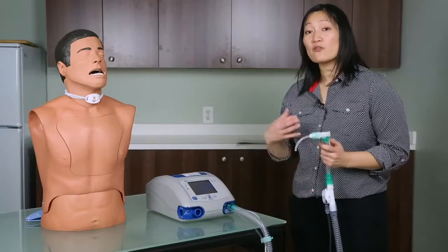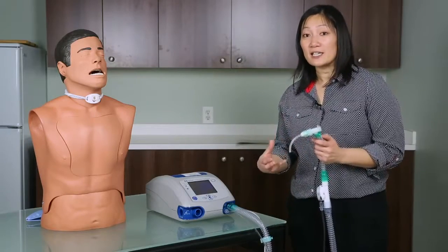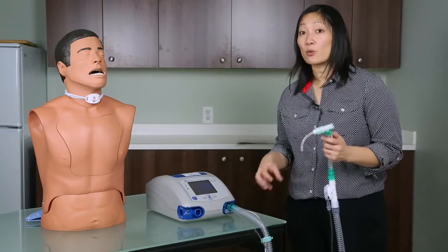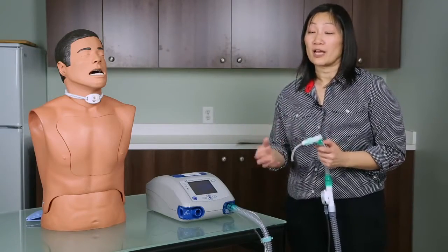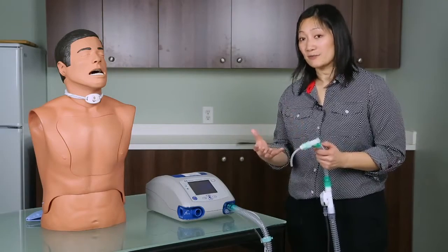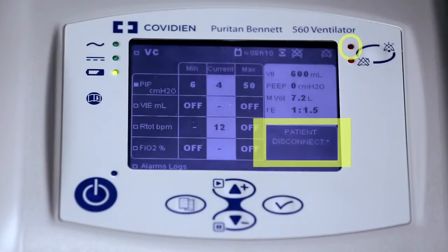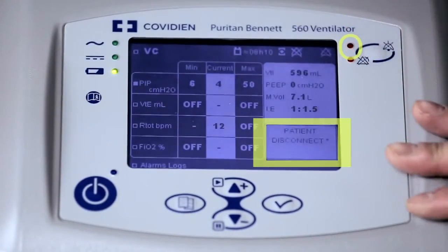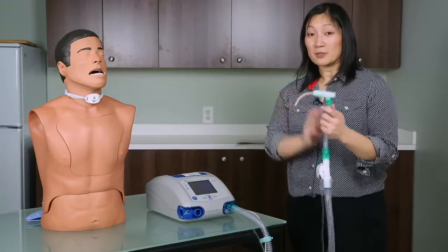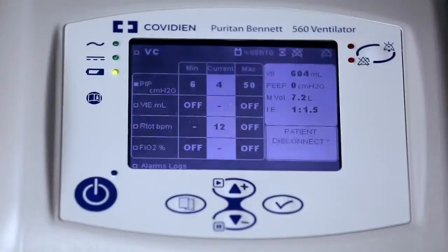After 3 to 4 consecutive breaths, the ventilator should sense distally that the pressure in the circuit is actually lower than the set low pressure alarm that we have now adjusted. So there you go. That's your low pressure alarm properly alarming visibly and audibly when the client is simulating a disconnection or a dislodgement of the trachea or tracheostomy.